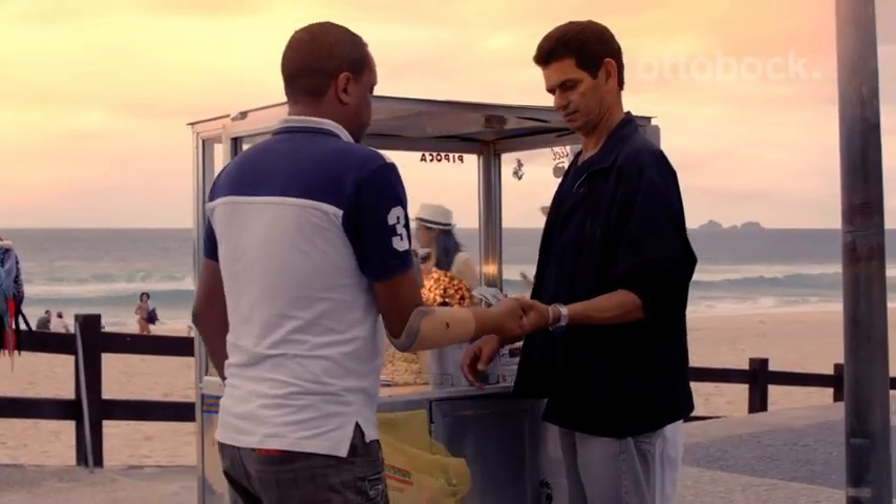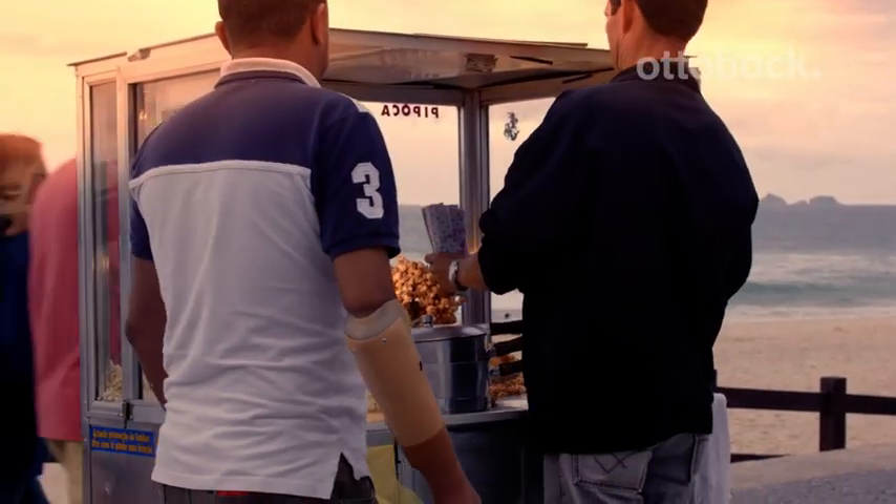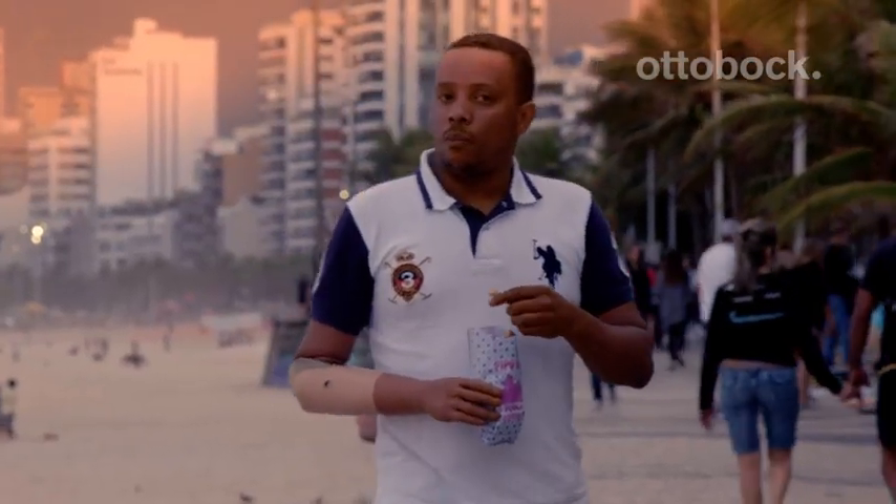This myoelectric prosthesis even allows me to hold a plastic cup, hold a knife to cut a steak, do various things and hold a pen to draw. I wasn't able to do these things with the other one.